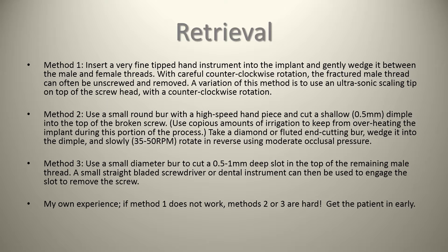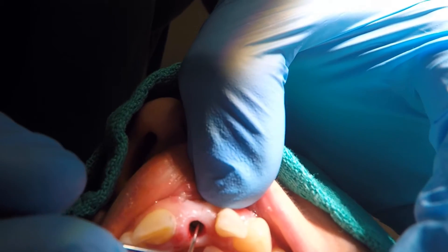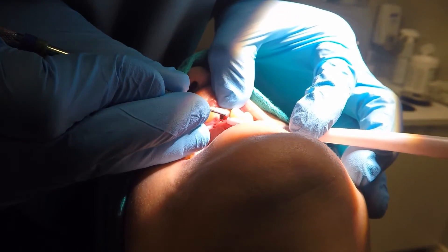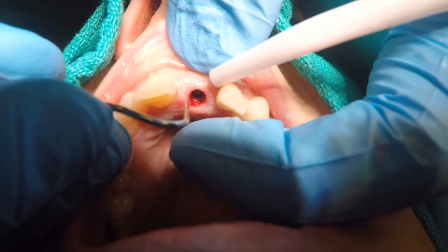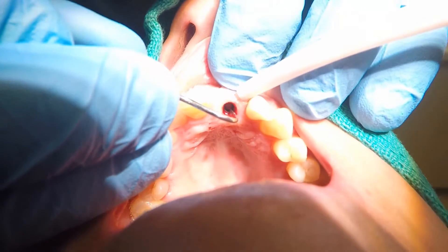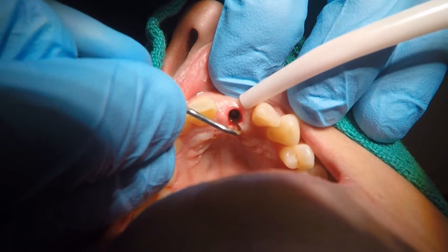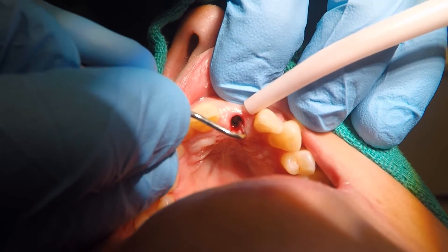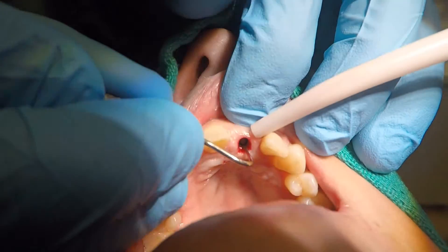So let's take a look at our video. You can see that I'm using an endodontic explorer, rotating it between the male and female threads in a counterclockwise direction. This particular endodontic explorer has a bit of a bend on the tip — this wasn't done purposefully, it was actually done accidentally by one of my assistants when sterilizing the instrument. The advantage of this bend is that it really helps give you a little bit more bite towards grabbing that screw head thread. It's just a matter of patience — it takes time, and sometimes it's only going to move a fraction of a turn each time, but being persistent with the same method, in around five to ten minutes you should be able to get this screw out.